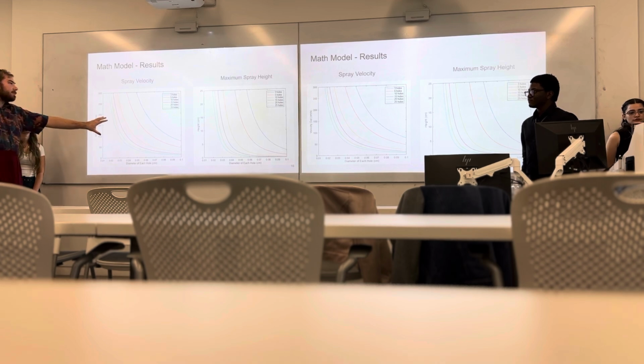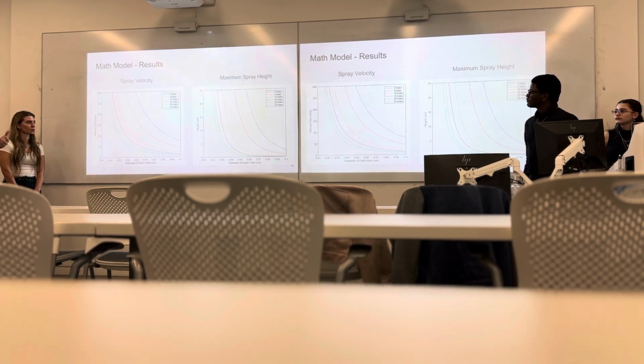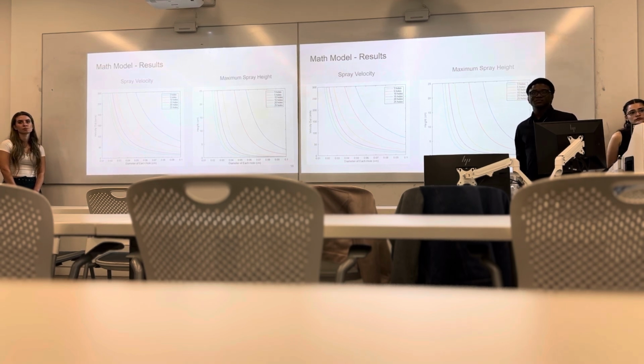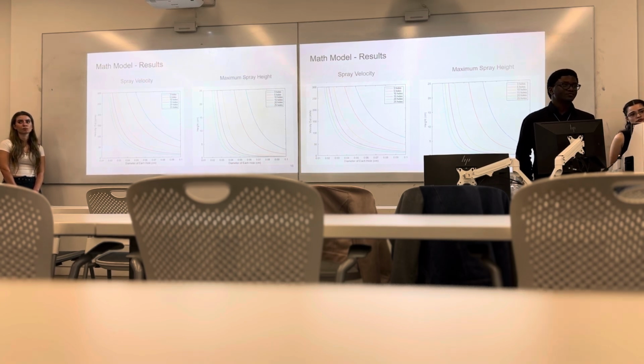Five holes was enough holes to hit all of the areas in between, and also maintain enough pressure and velocity to actually propel it.